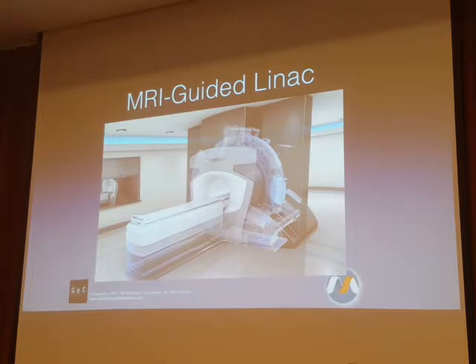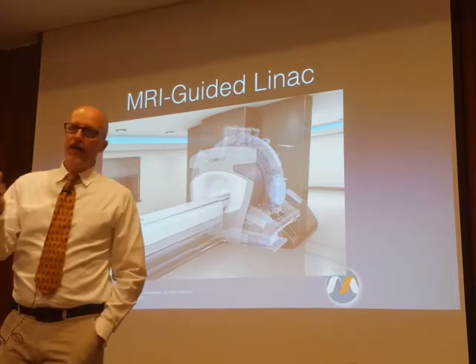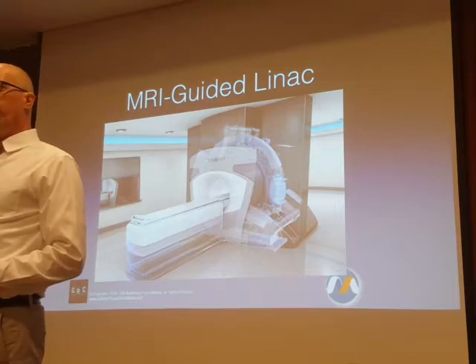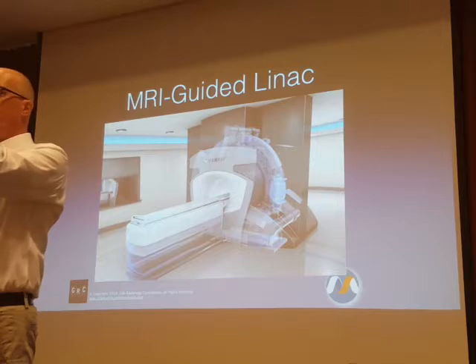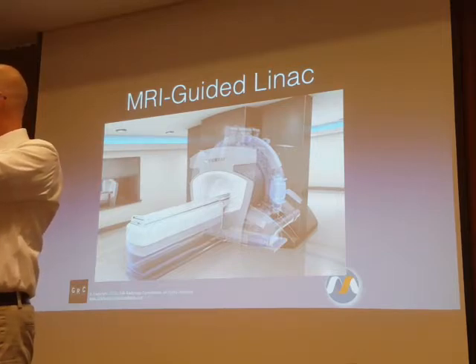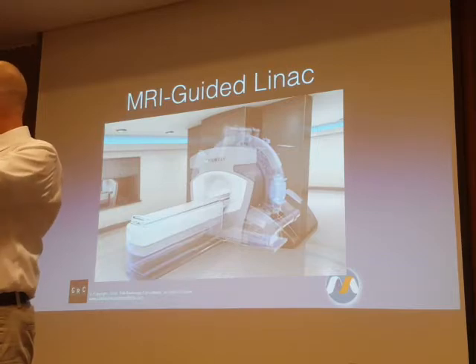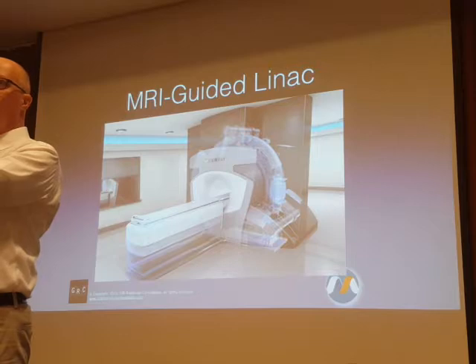We may be hitting healthy tissue. The MR-guided linear accelerators actually do real-time MRI imaging, and they essentially watch the tumor move with pulse and respiration. And they know when the tumor moves into the crosshairs of the linear accelerator beams. They turn the beam on when the tumor is in the beam, and they shut the beam off when it moves out.